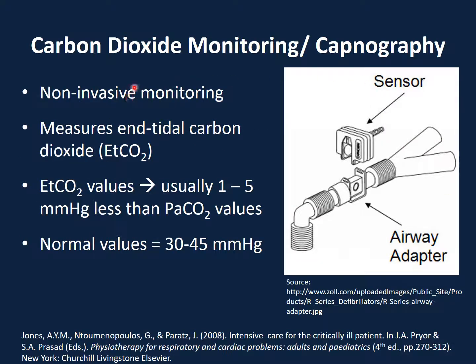So carbon dioxide monitoring, capnography, uses a sensor that detects the carbon dioxide at the end of each tidal volume breath. So that's what this end tidal means. At the end of each exhalation, that's the value that we're looking at.